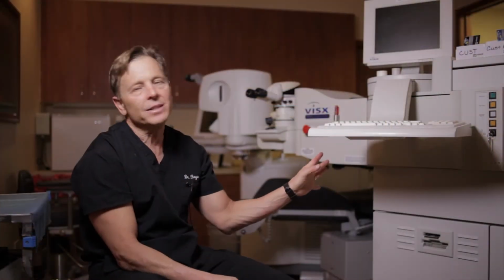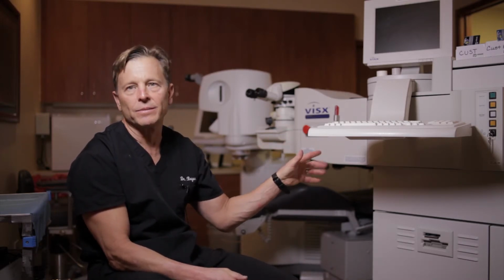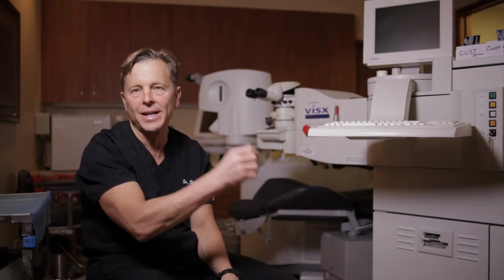With ASA, the procedure is slightly different. Instead of making a flap, we just use this laser, and we remove the surface with a brush, and then this laser reshapes the cornea from the surface. We put a clear contact lens on the surface, and the surface grows back within 4 days. So the recovery is probably 2 to 3 days different, but the overall safety and long-term stability is better with advanced surface ablation.